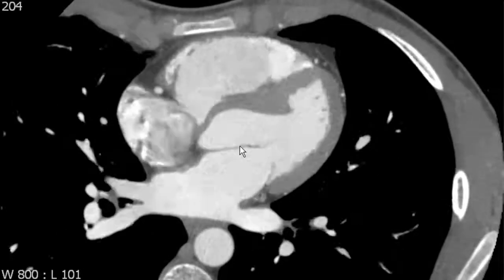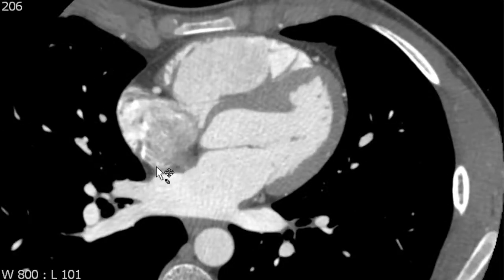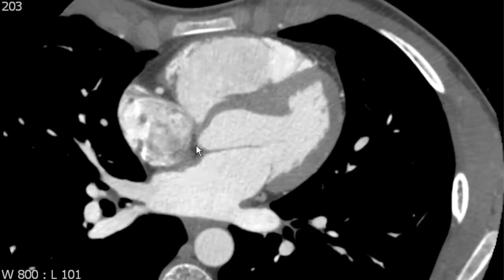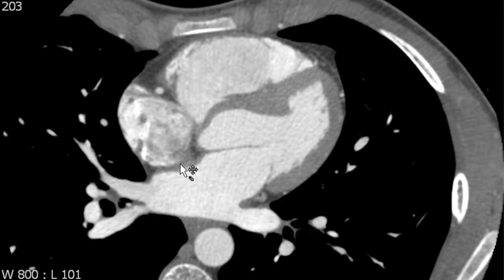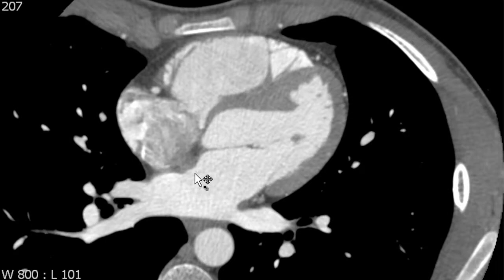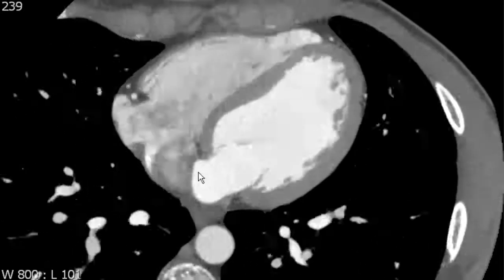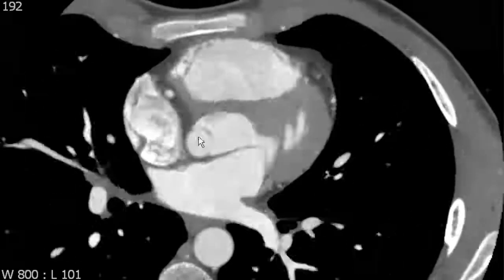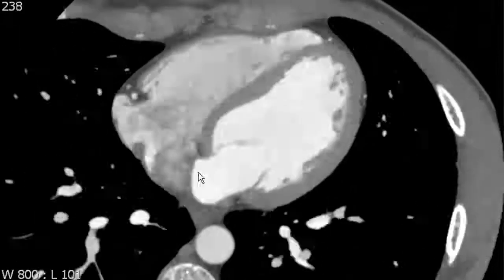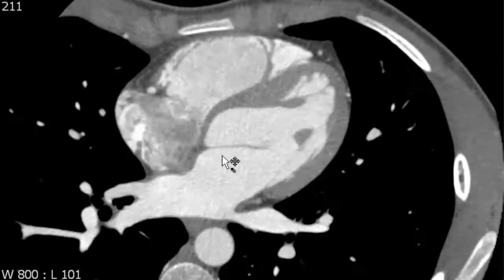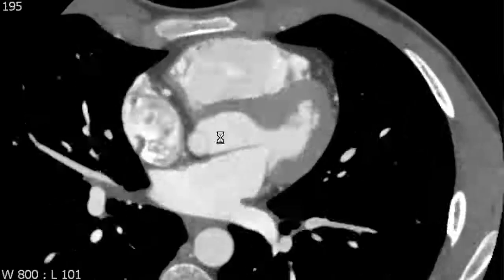Another important feature of the left atrium is the interatrial wall, which separates the left atrium from the right atrium. There is a fossa ovalis there that could be incomplete, resulting in a patent foramen ovale. If you see a blush of contrast extending from the left atrium into the right atrium on a cardiac CT, that can be evidence of a defect there — something you always want to look for.